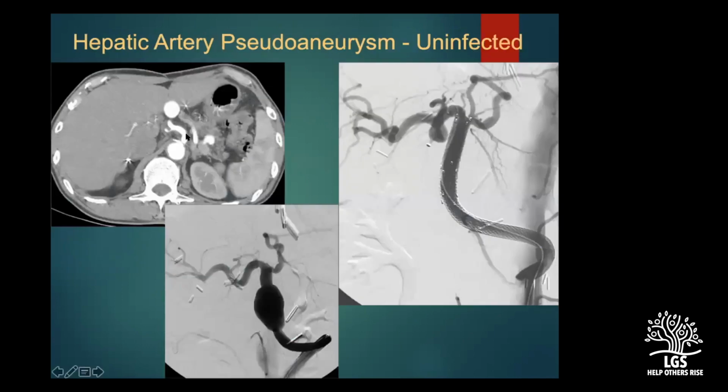Again, another thing which can go wrong is a hepatic artery pseudoaneurysm. Now, if there is a pseudoaneurysm like this, it's not necessary that we need to go in and put a stent across to sort the pseudoaneurysm. What we can do is inject thrombin. If somebody has a femoral artery puncture, if there is a groin pseudoaneurysm, percutaneous thrombin injection is a well-known and well-accepted form of treatment.